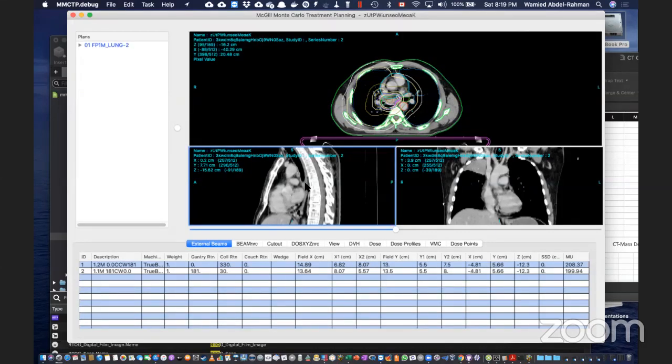So the point, me and Adri were discussing, is that when I imported this plan, automatically the beam was created and the label for the beam was 6. And I know if I had a 15 MV, the label is going to be 15. The question we have is, if the plan was generated with 6 triple F beams, will the DICOM have the label 6 or 6 triple F? If it's a 6 triple F, that's not a problem, because when I import it and I don't have that beam labeled 6 triple F, automatically it's going to generate it. And then I have to figure out the default input file, and so on.